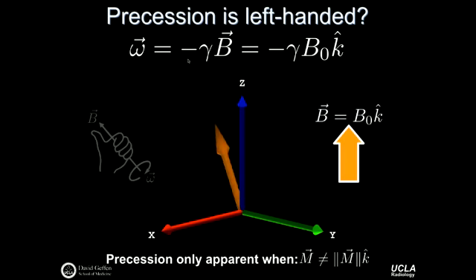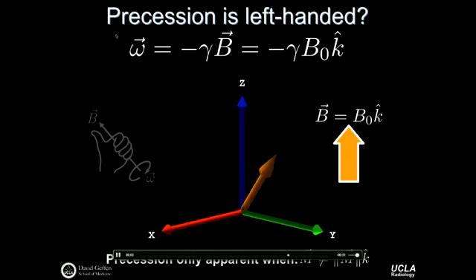And as such, we need a minus sign to be physically consistent. I guess you could have defined the gyromagnetic ratio the other way and not had a negative sign, but this is the convention that's used. So we want to remember that in pure vector notation, there is actually a minus sign in the full Larmor expression, if you will.